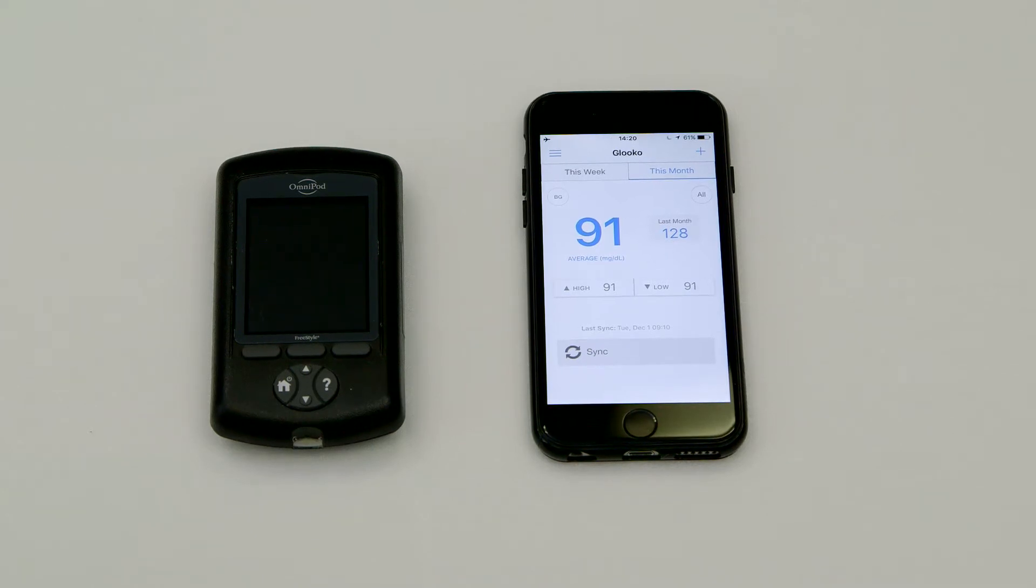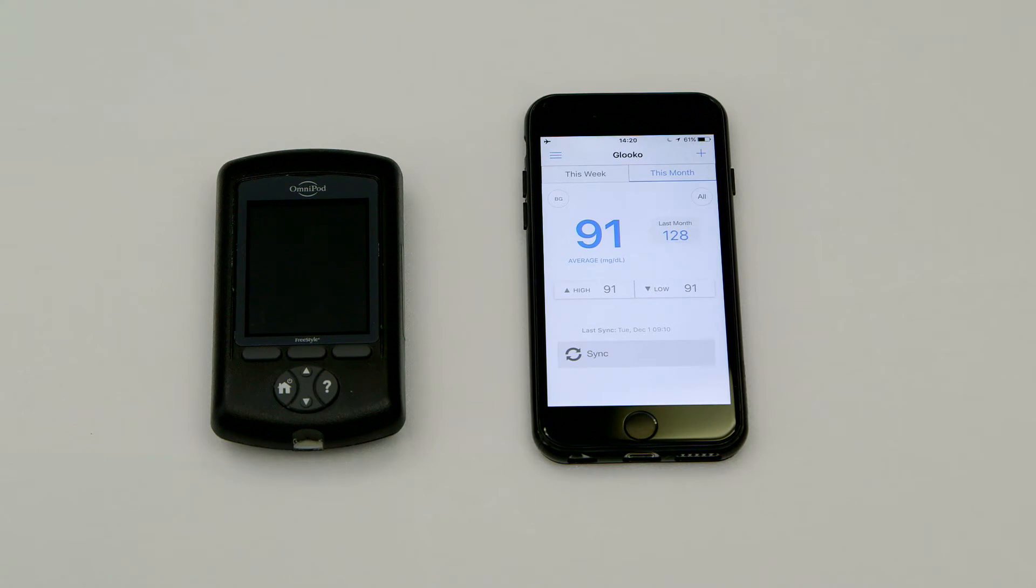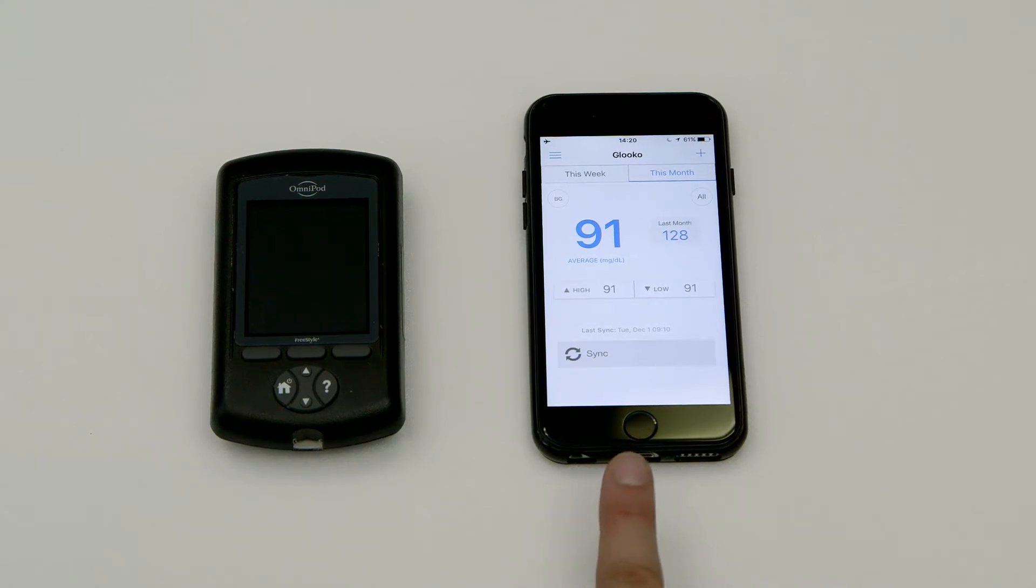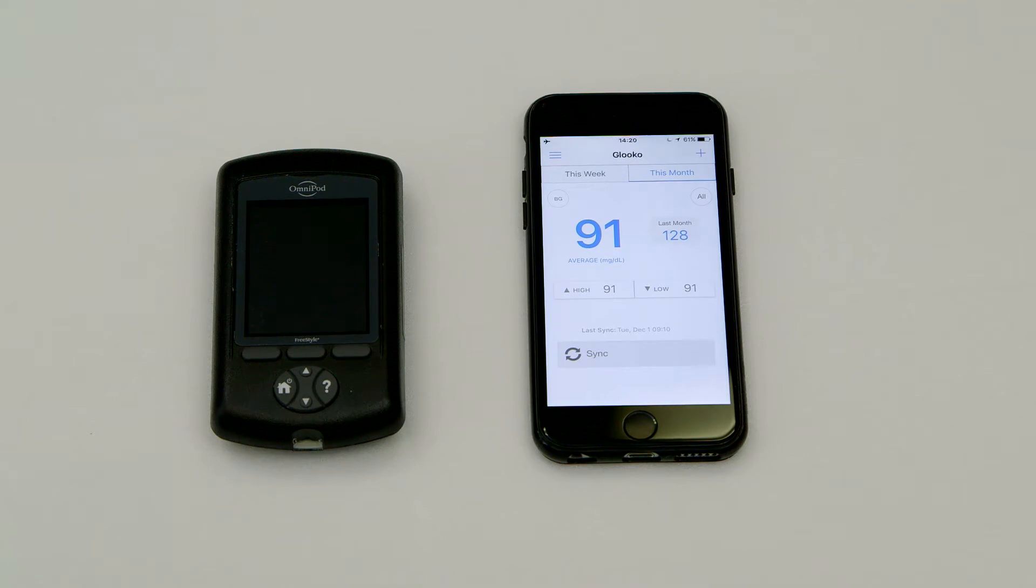To do this, you will need a supported iOS device with the Gluco app installed and previously synced data in your Gluco account.